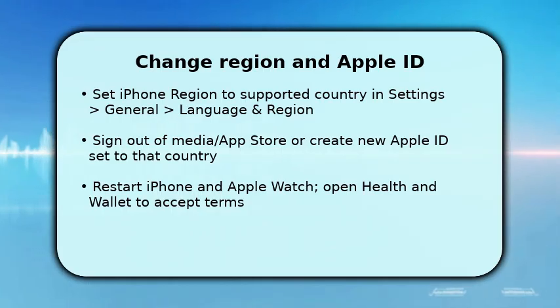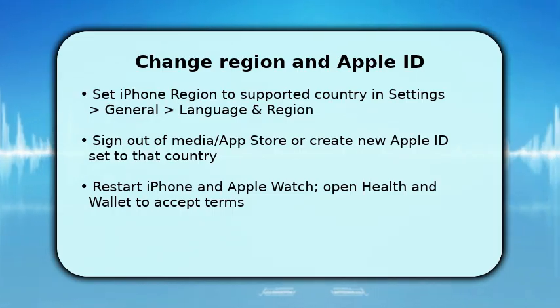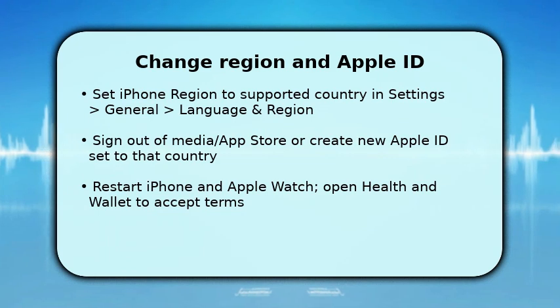Either sign in with a new Apple ID registered in that country, or change your existing Apple ID country in Apple ID account settings. After changes, restart both devices to force policy refresh. Make sure health permissions and legal agreements appear, and accept them so you finish by enabling ECG.